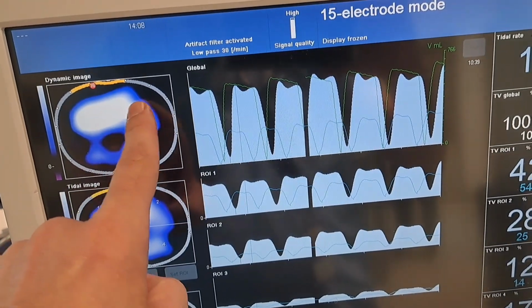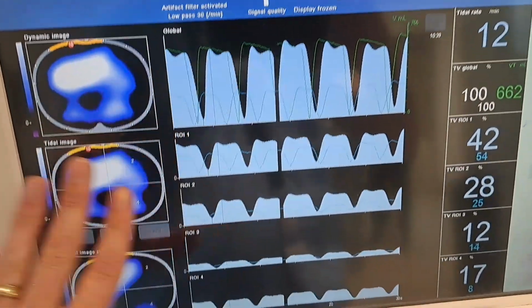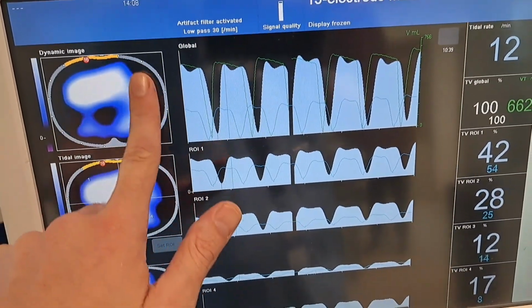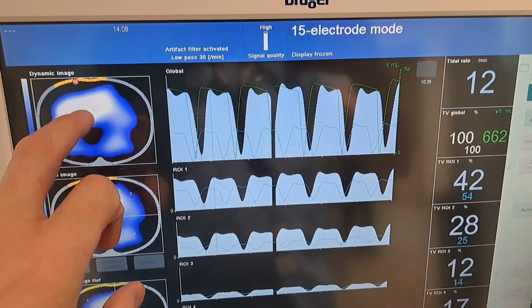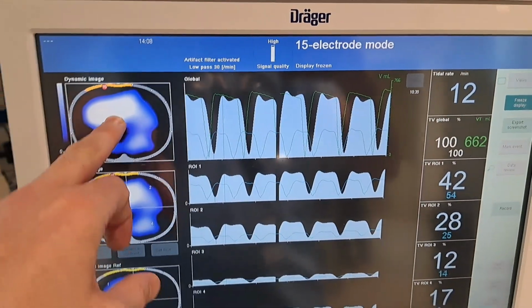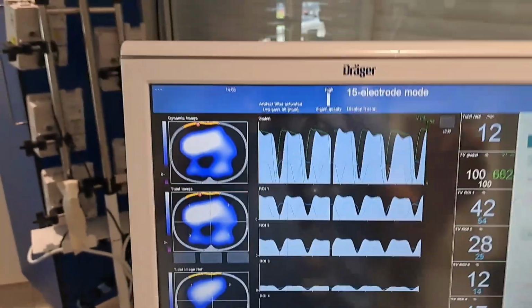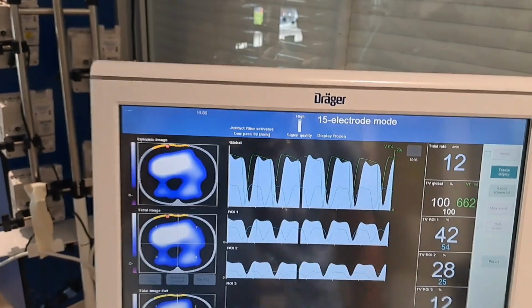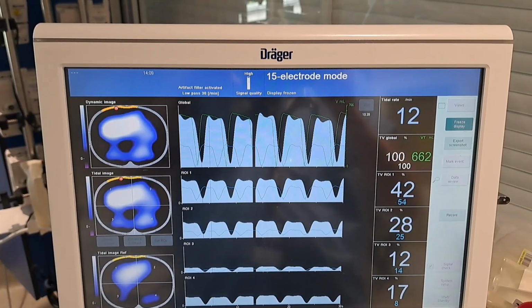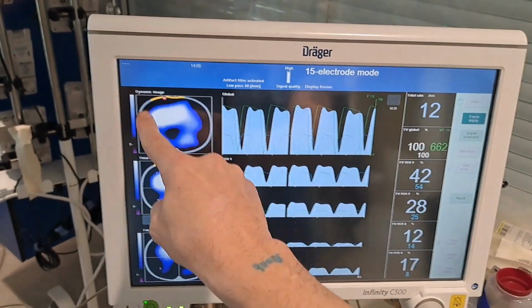But you know that there's a distribution that's coming down, and as the lung opens up over hours, you're gonna get a nice smoothing out. This will become less and less intense. Now, you should evaluate the white area, whether there's over distension by doing regional compliance, looking for orange. There's no orange there. Yeah, so I was saying, you should be evaluating.